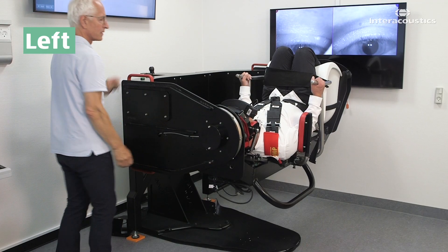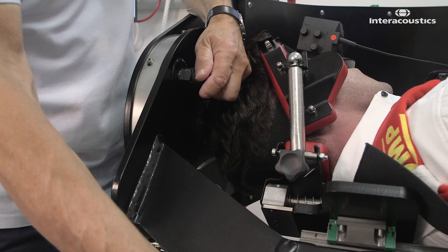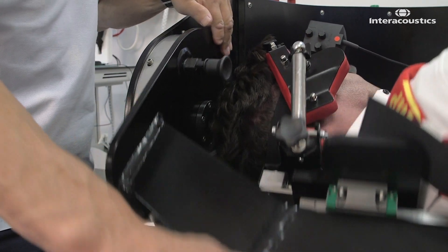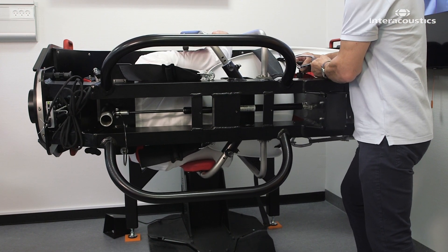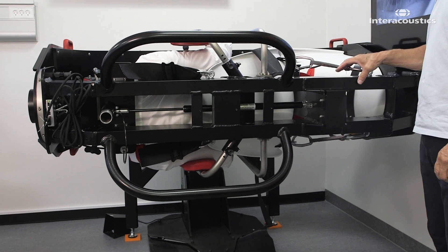Now lock the main arm of the chair. Then unlock the secondary arm by pulling the plunger and twisting it a quarter turn — the secondary arm can now move freely. Check that the secondary arm with the patient is well balanced. If the counterweight is positioned correctly, the chair will balance evenly and you can hold it in place with a slight touch.